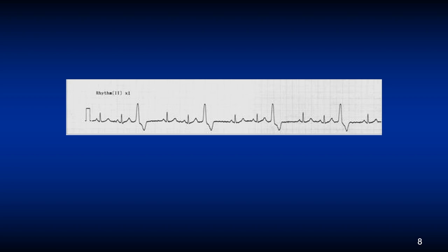Here we see two normal sinus beats and then a PVC, two normal sinus beats and another PVC, and this pattern continues throughout the strip. This repeating pattern is called trigeminy.